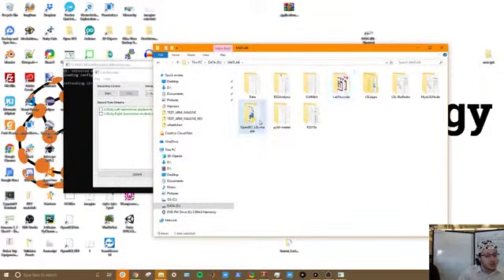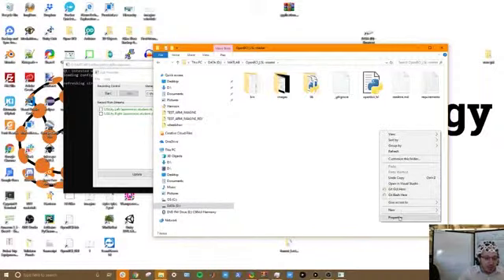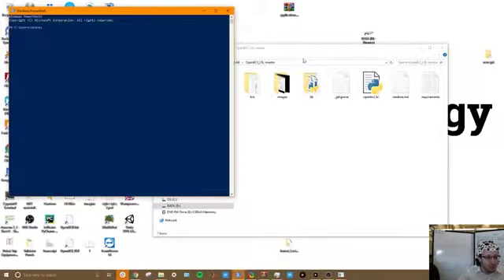There's a wonderful tool that someone created called OpenBCI LSL. And you can give thanks to the University of California, Santa Barbara for creating all these LSL tools because they're pretty fantastic. Not going to lie. So I'm going to open up PowerShell, and I'm going to move to this directory. So copying that directory, CD, and then I'm going to use Python.